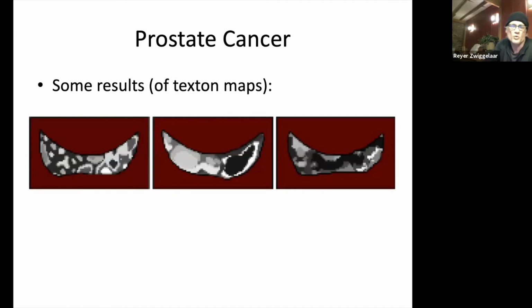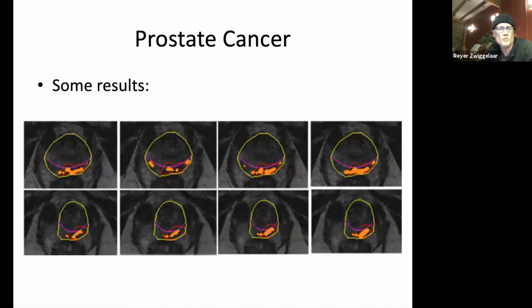And then if I do a probability map of the abnormalities, or of abnormal tissue, malignant tissue in this case, then I actually get images like this, where I've got a number of different prostates and different slices in the prostate, and they're annotated, and we find different areas within that. The orange is what the system has detected. The red boundary is where the abnormality, according to the radiologist, is. And as you can hopefully see, this is doing pretty well.